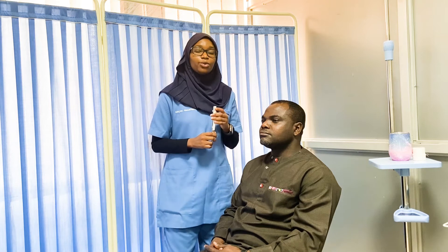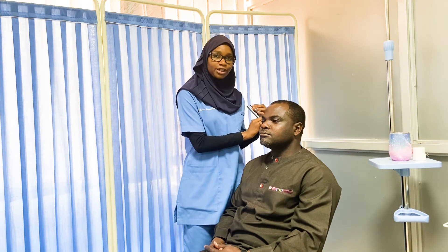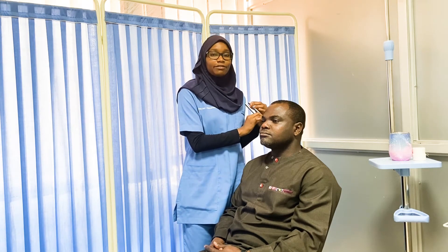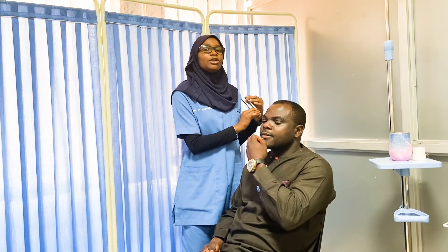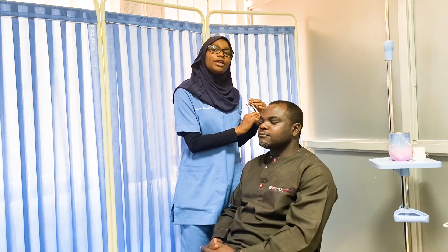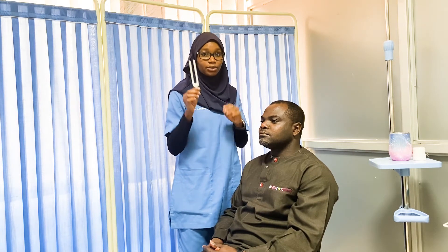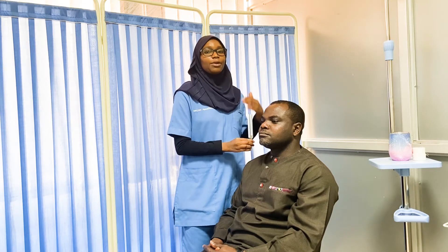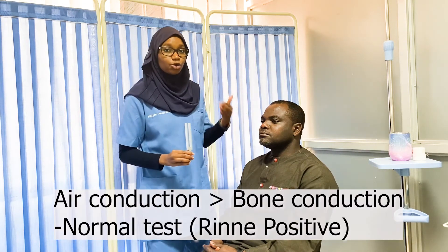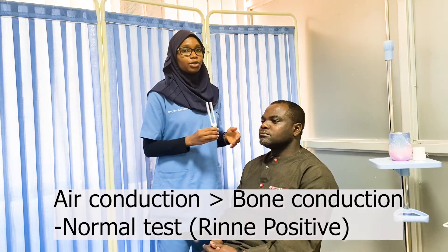We're going to start with the Rinne test. The way to do it is we make the tuning fork vibrate, place it on the mastoid process of the patient, and ask the patient if they can hear it. If they can hear it, we ask the patient to tell us when they stop hearing it. When they stop hearing it, we take the vibrating tuning fork — we keep it vibrating — and bring it next to the ear of the patient. The patient should be able to hear it in a normal situation because air conduction should be more than bone conduction.